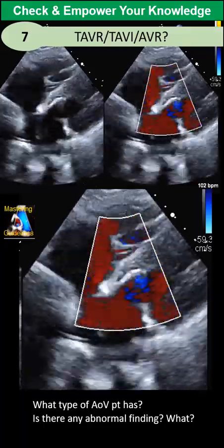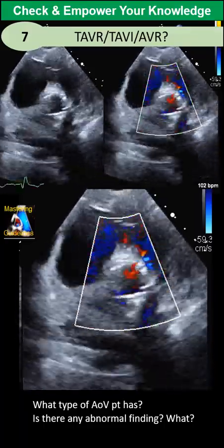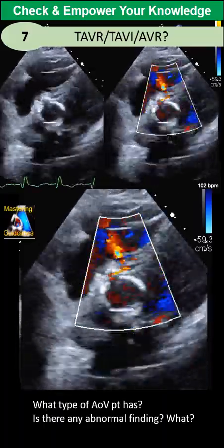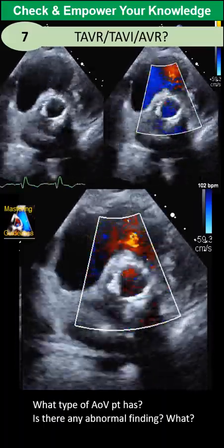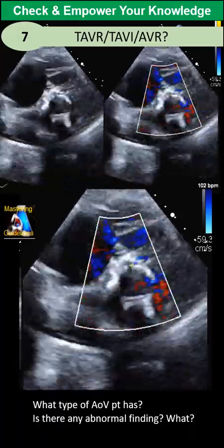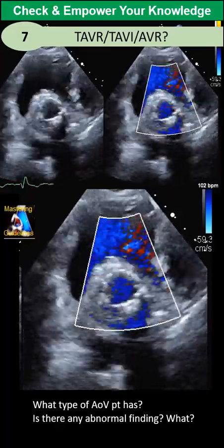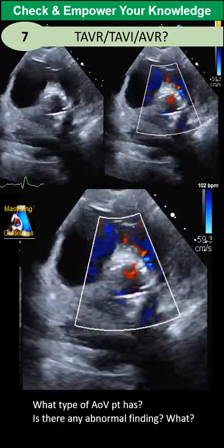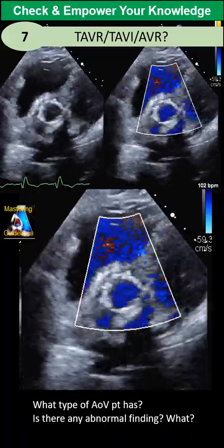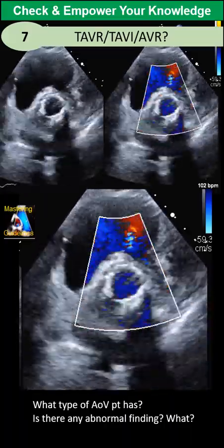First question: can you tell what type of aortic valve this patient has — native, TAVR/TAVI, or AVR? What are your landmarks to determine which type of valve the patient has? Second question: do you see any abnormal finding in this case, besides the mild hypertrophy of the left ventricle?